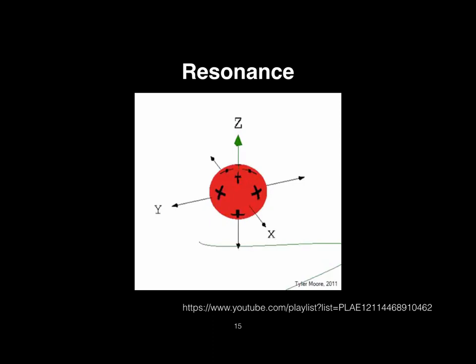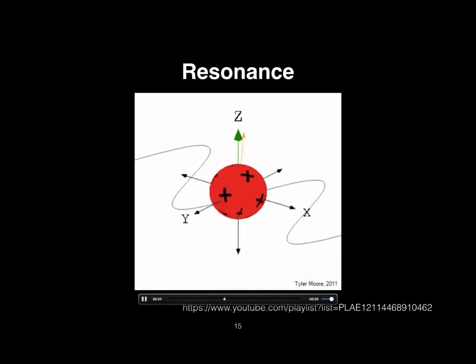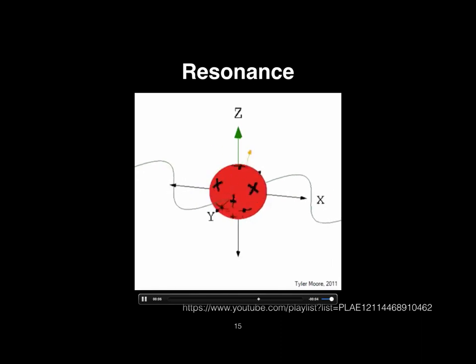So if you look at what's happening to this magnet, this now is going to simulate the RF field. So this is where we inject energy into the system to kind of tip that magnetization away from its alignment with the main field. You can see as it's pointing here, you're hitting the tip, and as the magnet's pointing here, you're hitting the trough of the magnetization. So in essence, as this little molecule is rotating around the field, you're essentially injecting energy at that same rate. Okay?